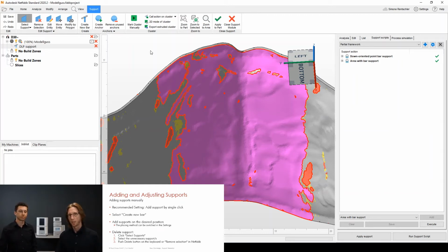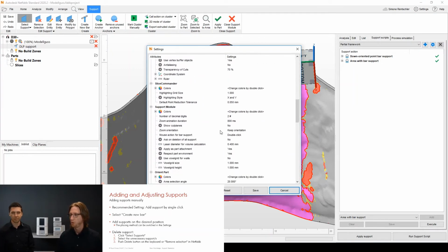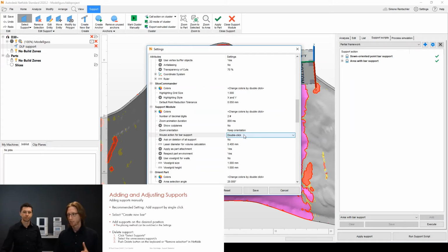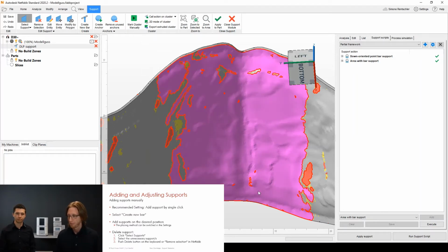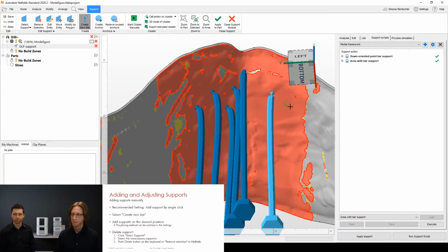Now, in order to change that, we go to the settings button on top, again on settings, and there we just scroll down all the way until we have found the support module in here, this one. And what you see here is there's another option for the mouse action for bar support, and as I mentioned, default setting is double click. Please select the single click and save. And now, as soon as I hit the create new bar button again, I just have to make a single click, and as you can see, it will just perform really nice and easy.